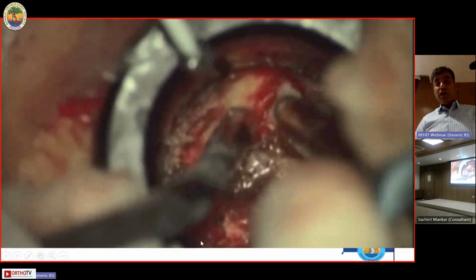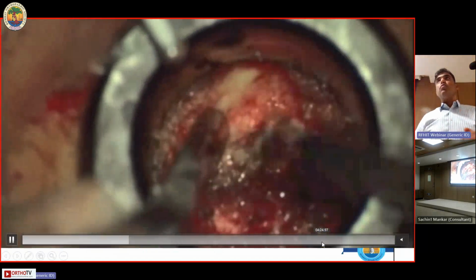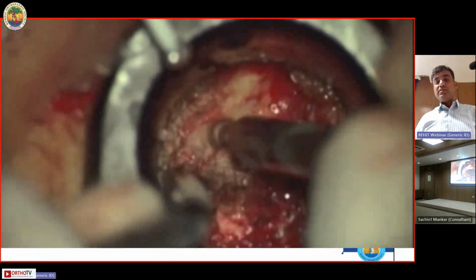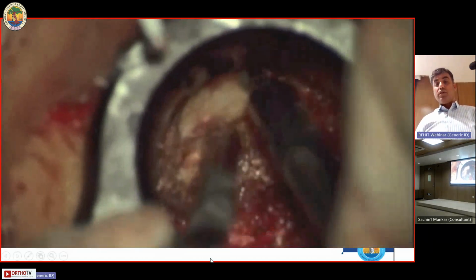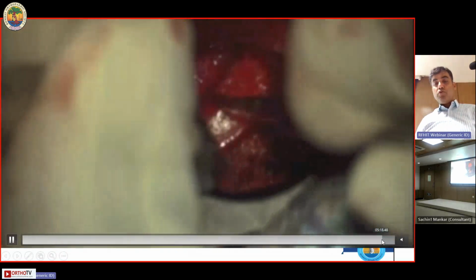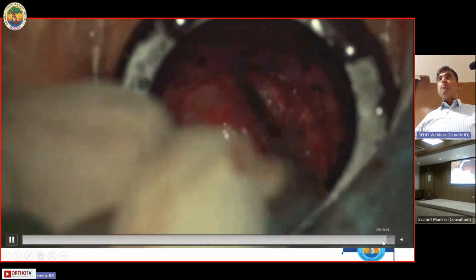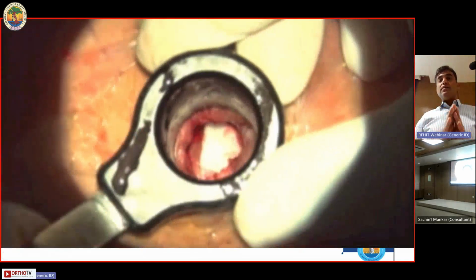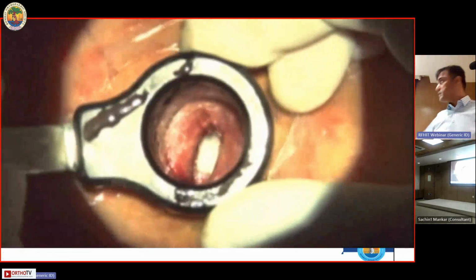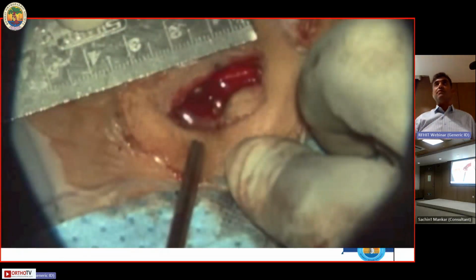The advantages of this procedure are that you do not have to really go through the midline, and you don't have to take the fascia away from the insertion on the spinous process, and the posterior tension band is absolutely not disturbed at all. And the moment your tube comes out after your decompression, as you see here, the whole muscle space will just fall in and there is zero dead space. As you see, all the muscles will just fall back and the fascia just approximates to itself, requiring just 1 stitch out there without any problems.